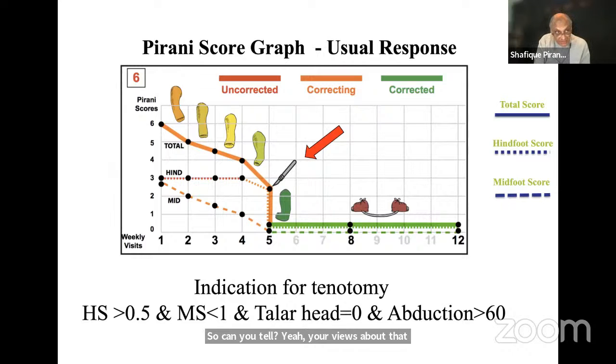I think they say use an 18 gauge needle, if I remember correctly. So the size difference between an 18 gauge needle and a 15 blade with a stab incision, especially a Beaver blade, if you have access to it, or cataract blade, is not that big. The difference I see between the 18 gauge needle and a blade is a blade has an edge to it that's designed to cut. An 18 gauge needle has a sharp edge which is curved, which is designed to penetrate.